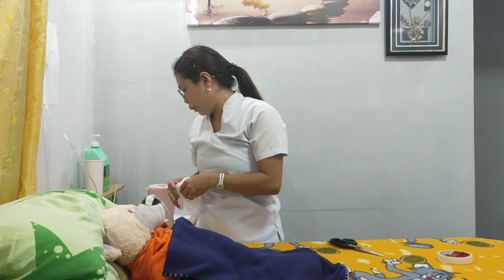And last, use only a water-filled syringe and apply pressure to the plunger to unblock the tube if your patient is experiencing any of these symptoms. Do seek treatment immediately. Take off your gloves, wash your hands, and lastly, report and record the procedure.